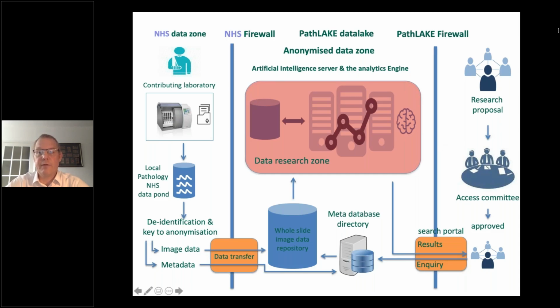To gain approval to the data lake, one applies to our access committee, which is staffed by representatives of each of the NHS organisations contributing data, and functions a bit like a tissue bank or ethics committee to vet the validity of proposals coming in. Those which are approved are then given access to the data that's required for the studies they wish to perform. So we don't give the data away, we allow access in, and we allow researchers to load their code on our analytics engine, conduct the experiments, and export the results.